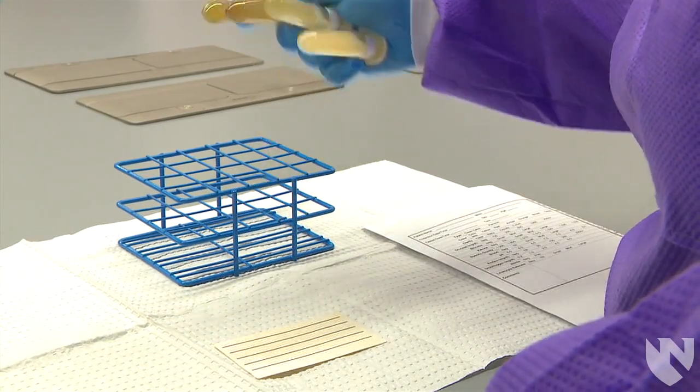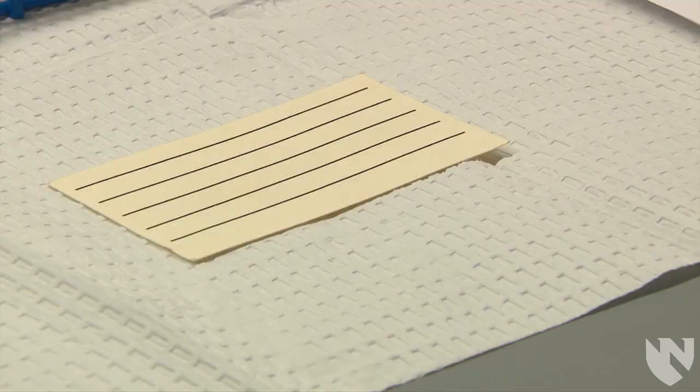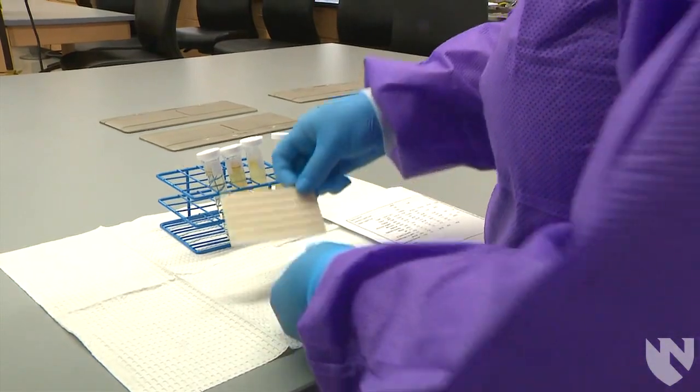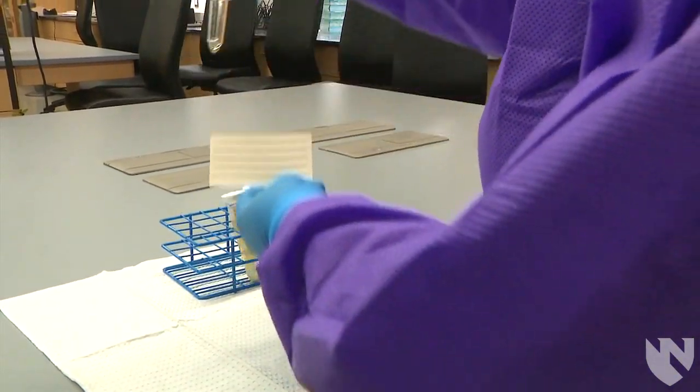To evaluate the urine clarity, we will hold the urine conical tube against a lined index card or you can use any sheet of paper with black text on it. In this video, we will be using an index card with lines.